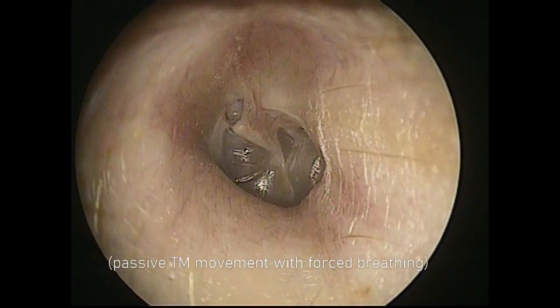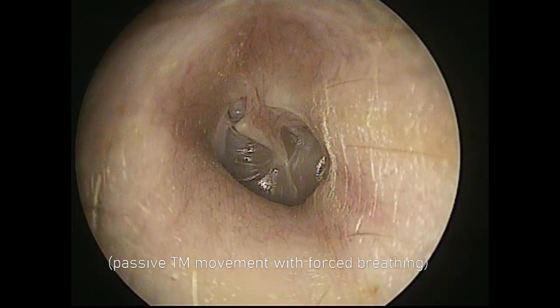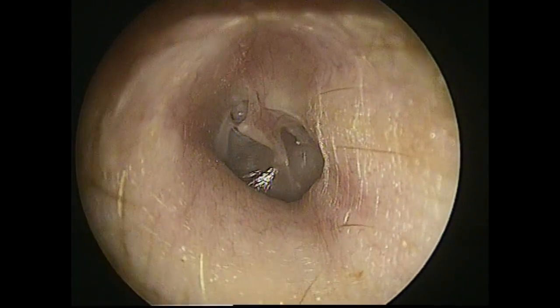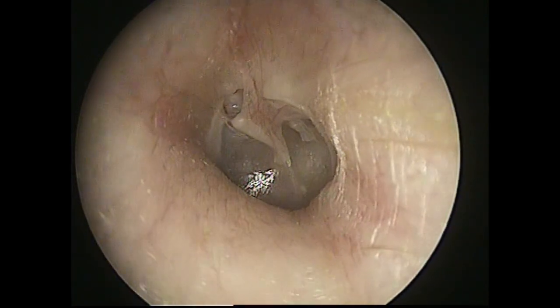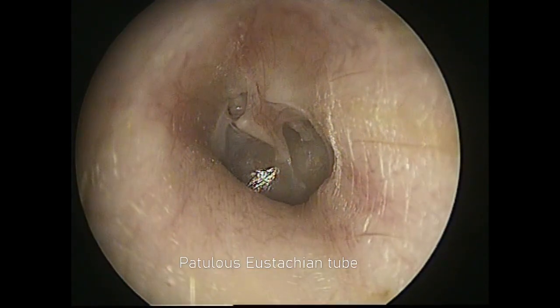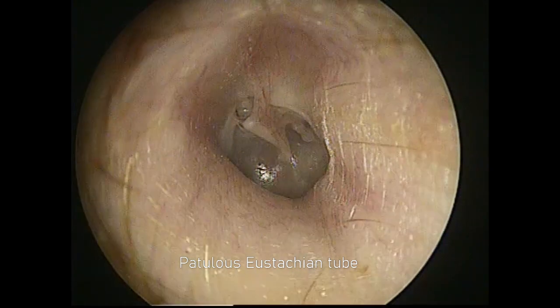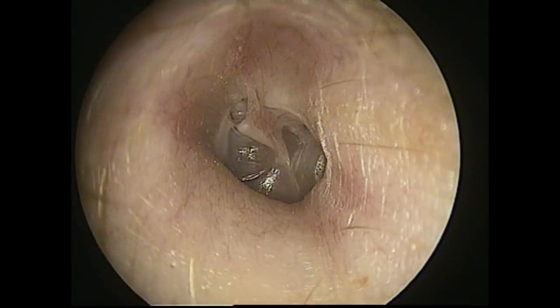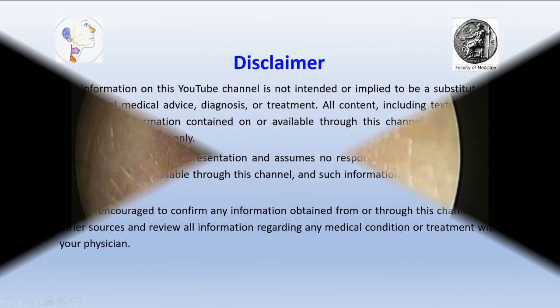In this case, the patient has tympanic membrane retraction combined with a permanent opening of the eustachian tube, which is normally closed. This condition is called patulous eustachian tube and causes continuous movement of the weak tympanic membrane with pressure differences caused by breathing.